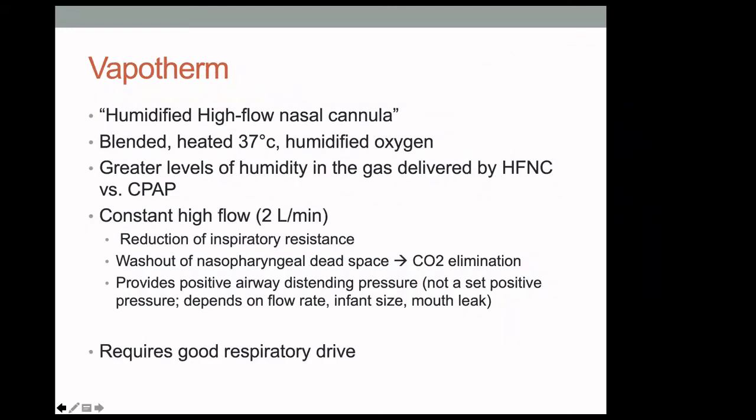So I'm just going to speak a bit about vapotherm as well. I come from a unit where we use a lot of vapotherm, so I'm quite familiar with it. It's basically humidified high flow nasal cannula oxygen.